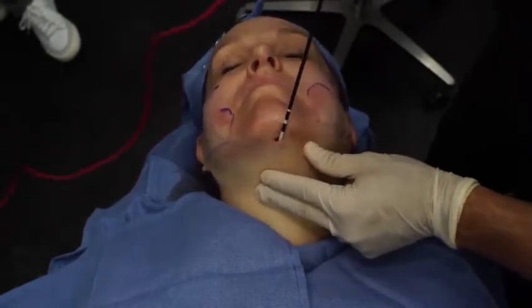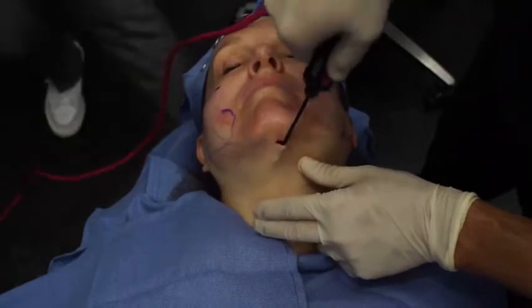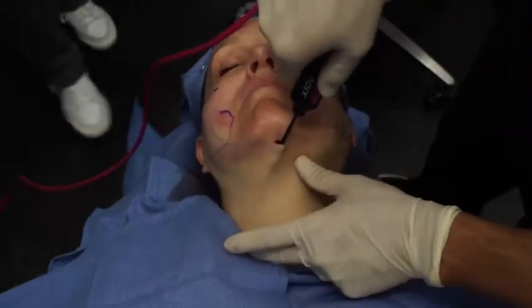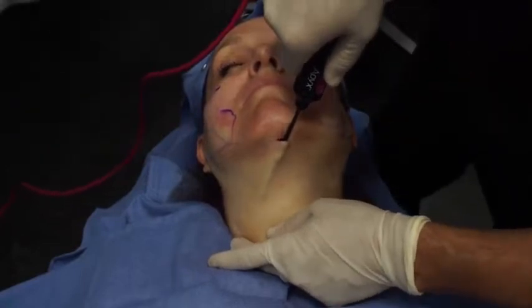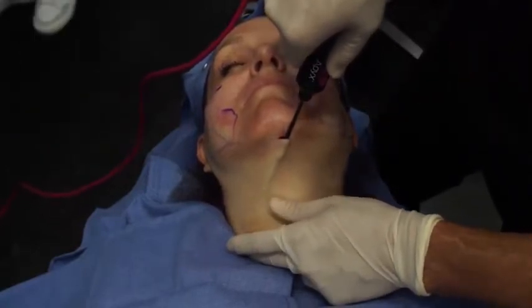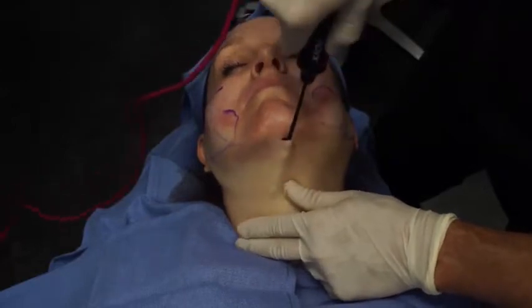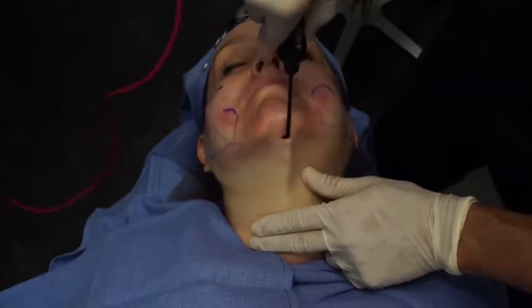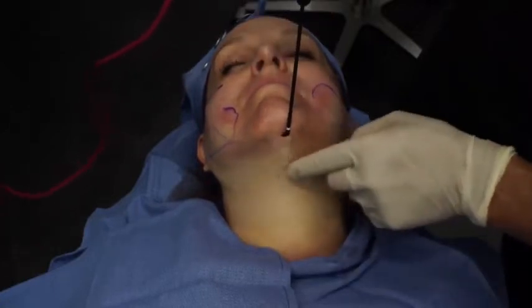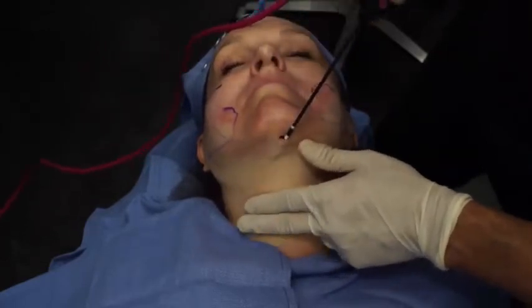Here we go again. We're going to go ahead and go anterior. We know that we have nice movement, no obstruction. We are going to get to the distal point. Here there's an obstruction. If you activate it, there can be an occlusion or an endpoint burn. So we'll bring it back just a little bit and then just activate in retrograde fashion in these serial strokes. Notice that we are not adding too much energy to this point right here, but we are pretty superficial.